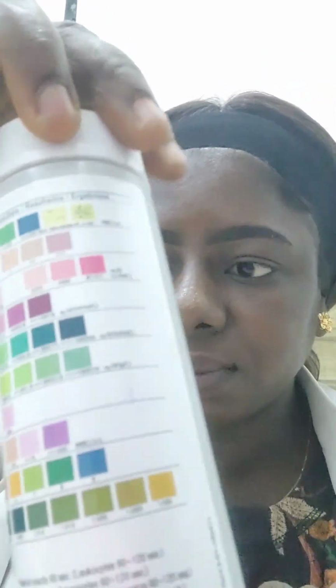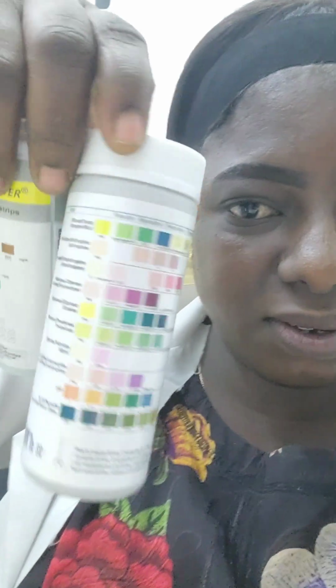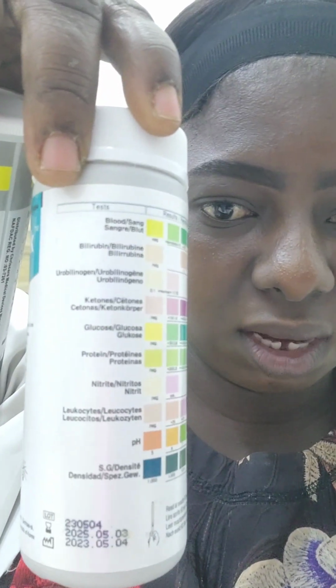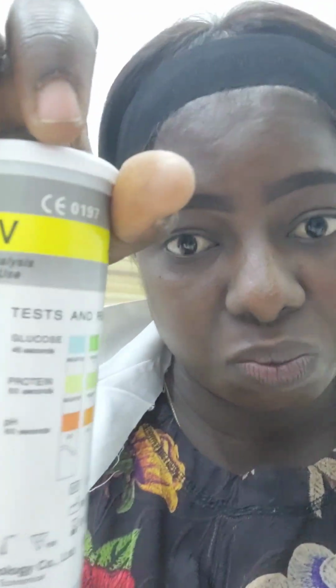This is the same test kit, but this one has 10 parameters, as you can see. This other one has 3 parameters. It only has glucose, protein, and the pH. The pH, it will tell you the pH.